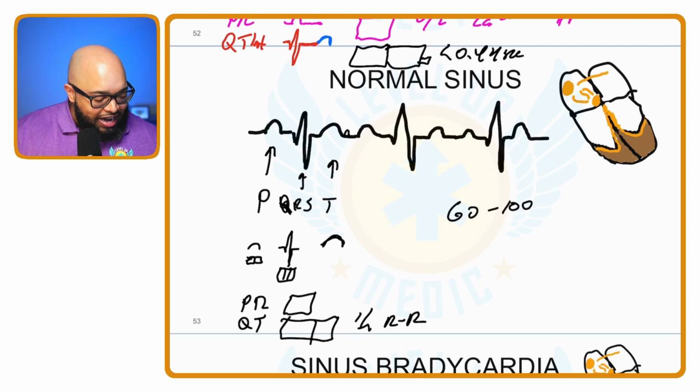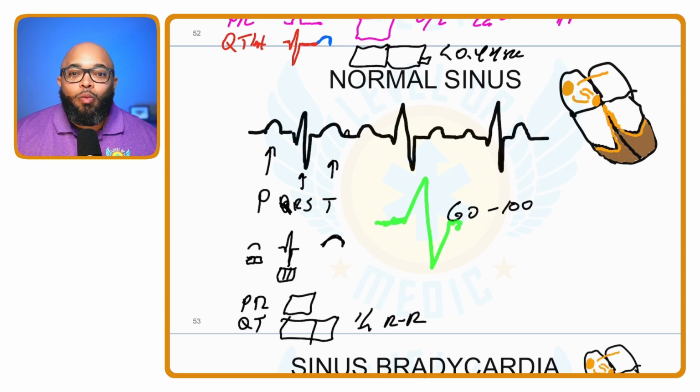Okay. Let's go into the QRS. It's supposed to be narrow, but what if the QRS is instead wide? Okay. A wide QRS means that there's some kind of ventricular problem. It's often associated, for instance, with a bundle branch block or some other kind of conduction delay. So a wide QRS could be a conduction problem. It could be a bundle branch block.